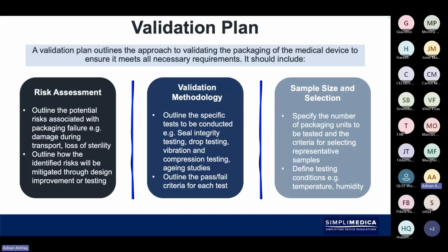The testing that will be done for the packaging validation specifically is there to mitigate risks, which could be to do with seal integrity. That seal could be compromised. It could then cause bacteria to get into the device, which is otherwise sterile, and it could then cause the device to become non-sterile.